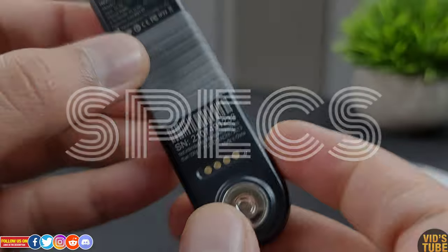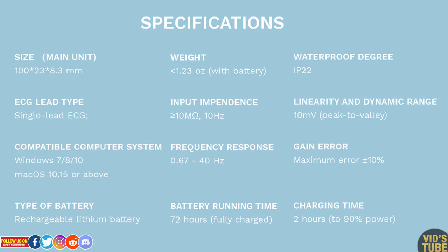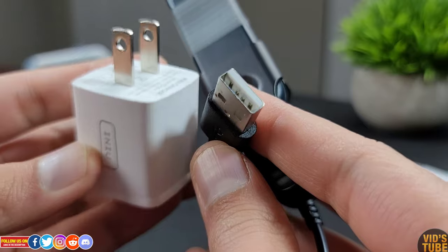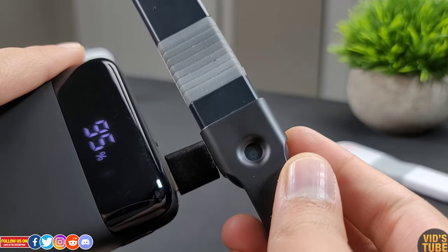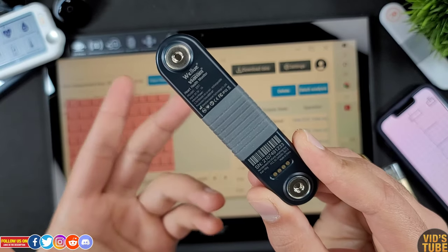In terms of specs, just pause this video to read through the spec list. The charger has a USB Type-A on one end which goes into a wall adapter that is not included, or you can use a power bank or plug it into a PC to charge the device. You can also use the same cable for data transfer.